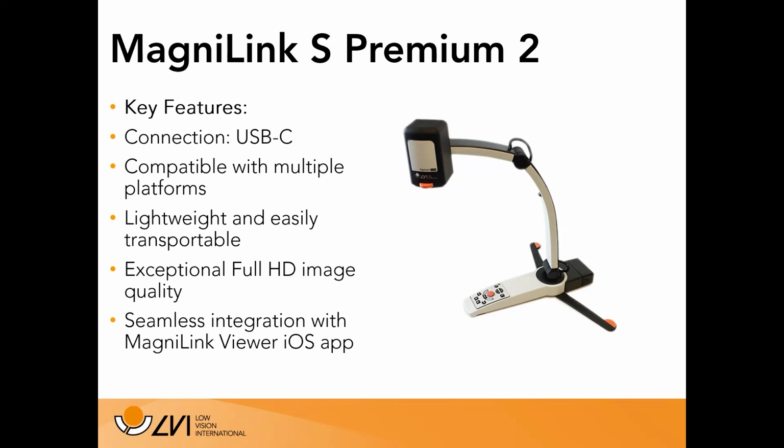And instead of using software to control it as you would with an iPad or with a PC or a Chromebook or a Mac computer, you can use this just with a standalone monitor and control it with those tactile controls on that foot. It is very lightweight, again, about 4.3 pounds, and easily transportable. You fold it down, pop it in our little case, throw it in your backpack, and off you go.